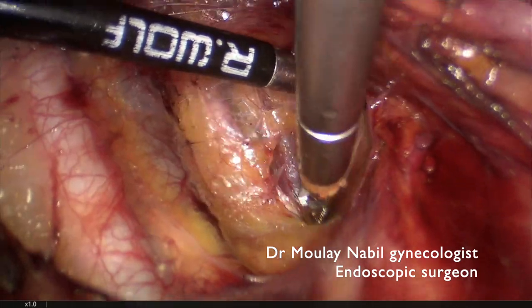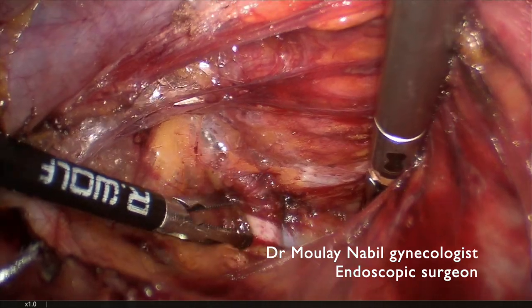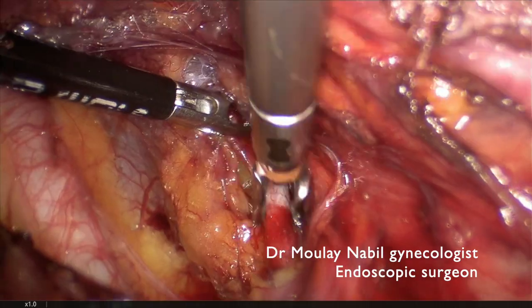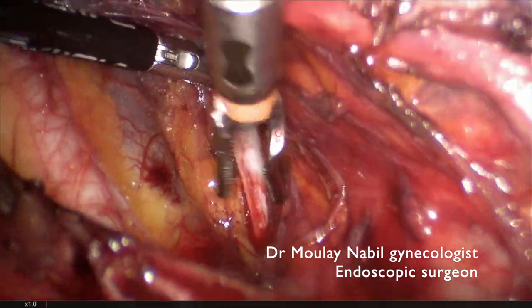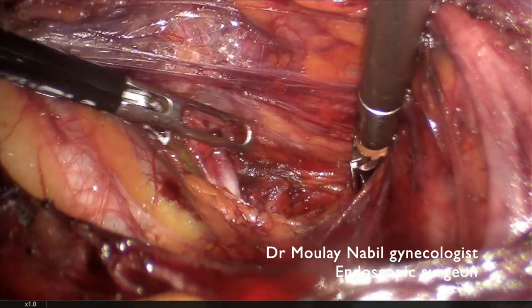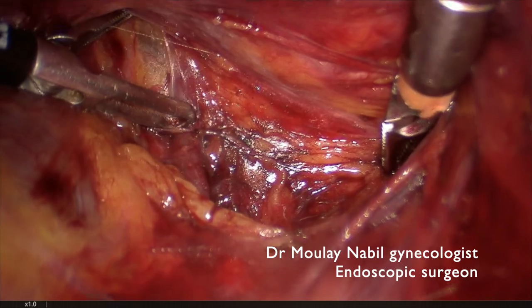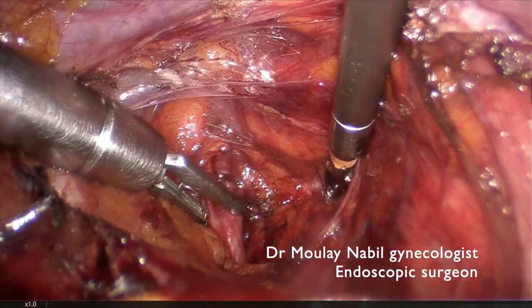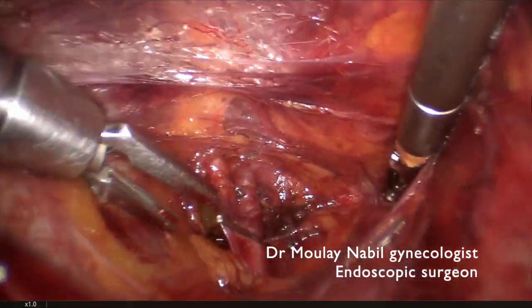Before its utero-umbilical trunk, you can see we discover the internal iliac artery lateral to the ureter, and you can see the utero-umbilical trunk just above our device. We can now clip, with absolutely no ureteral danger, this artery for good uterine devascularization. The clip is placed just before the umbilical trunk.